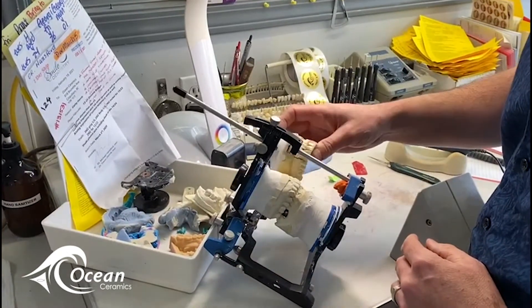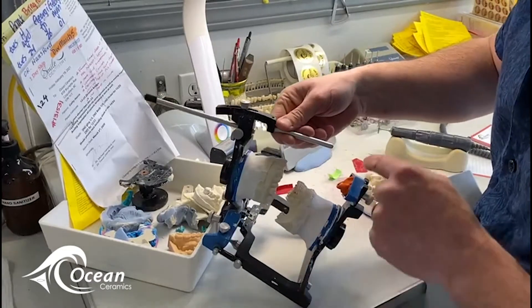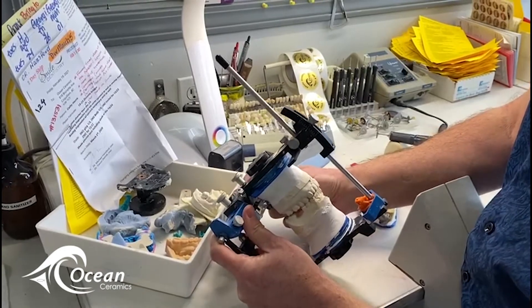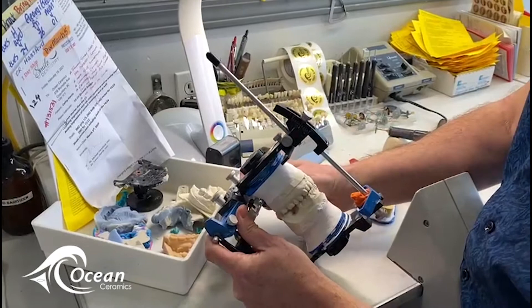Everything looks great in the front. What we do is we actually take some obite and we inject it here, and on the articulator here we're going to make what we call a custom guidance table in accordance with the guidance of this anterior here.